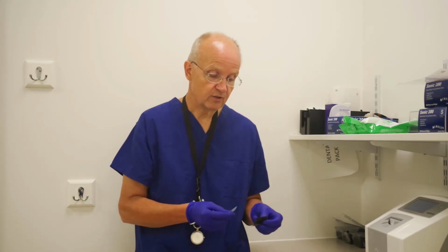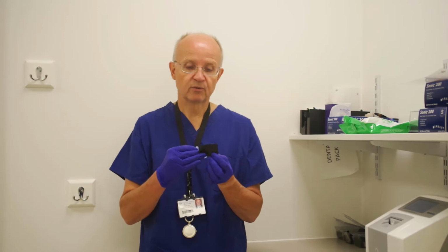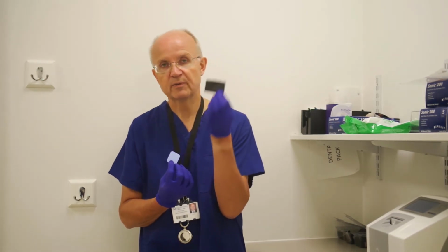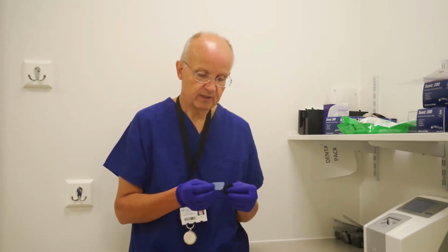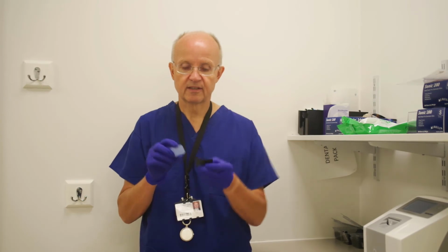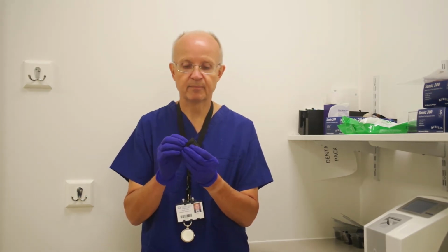So what we're going to do is use one of these little saliva barriers, but it's also opaque on one side. This one happens to be black on that side and clear on the other. What we need to make sure that we do is place the plate into this packet like that, so that the phosphor is covered up by the opaque side.